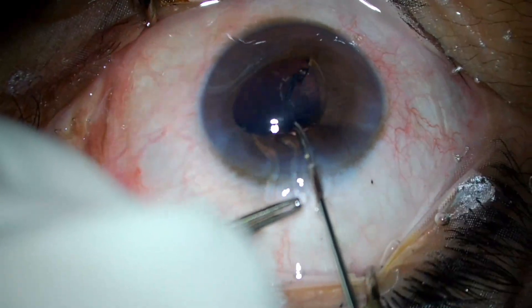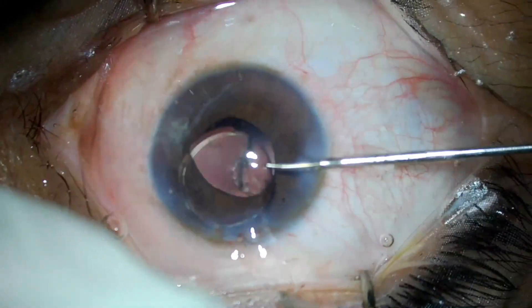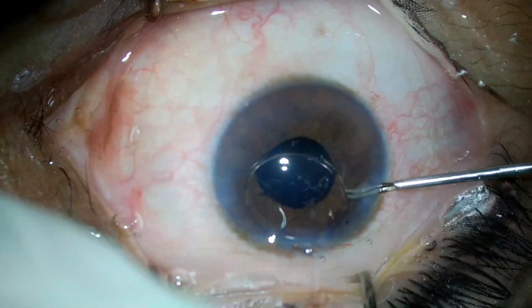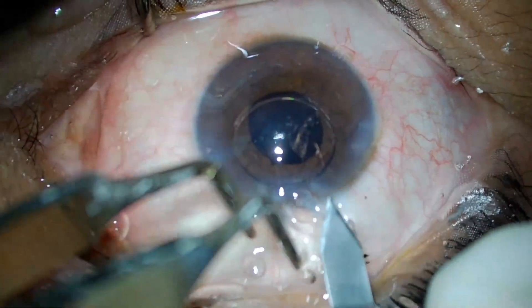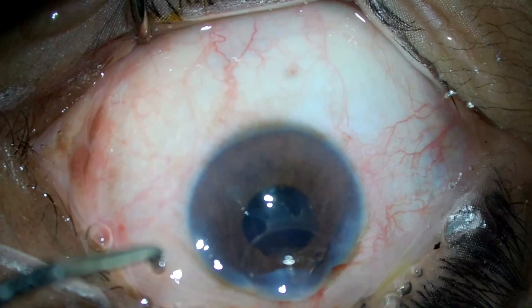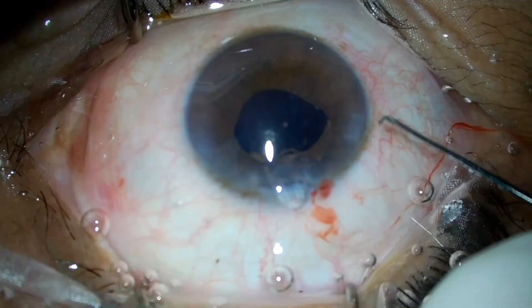Apart from early PCO, another potential complication of hydrophilic acrylic lenses is cracking during insertion. Here is a case of a cracked hydrophilic intraocular lens noticed on post-op follow-up dilated examination. The IOL is cut with micro-scissors under viscoelastic substance, the tunnel is enlarged with a keratome, and the IOL is explanted. Posterior capsular integrity is checked and a new foldable IOL is implanted.